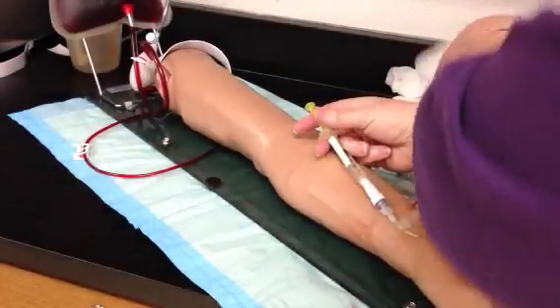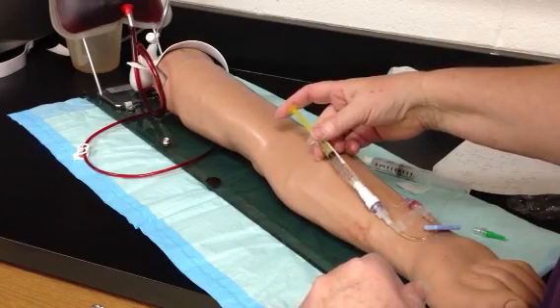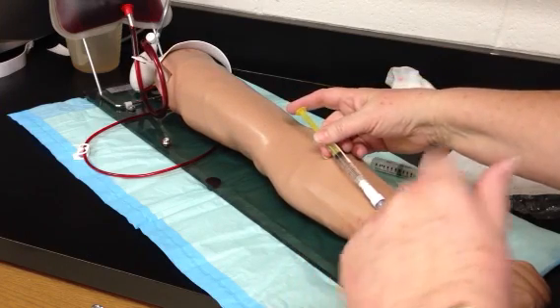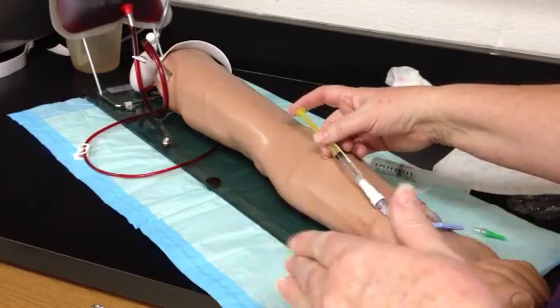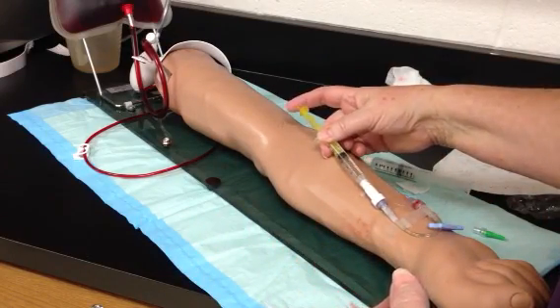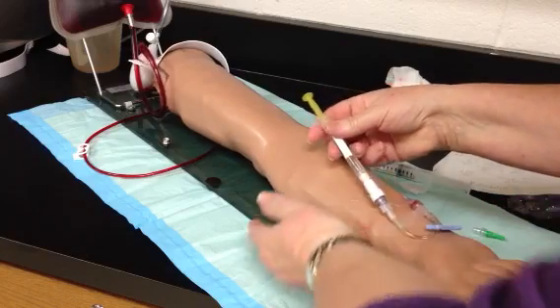Okay, so I'm going to be watching my watch, and turn that around there some, and then I'm simply going to push 1 line, and then I can, rather than doing it 1 line every 9 seconds, I'll do it 1 line every 10 seconds because it's easier to watch on my watch. Wait that amount of time, 10 seconds, and then I'm going to push another line. Every 10 seconds I push a line. I don't have it screwed in there good.